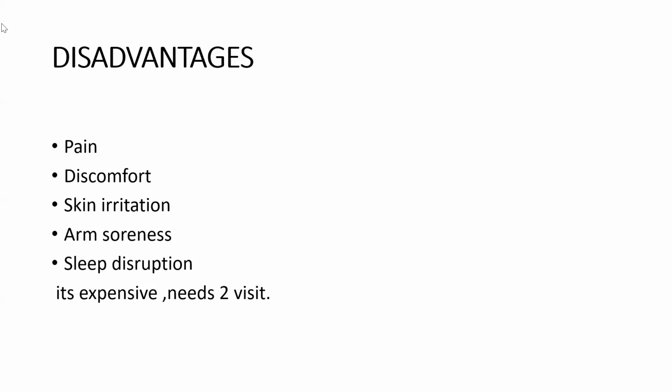I don't know if it's the same thing as nocturnal hypertension. And then there are extreme dippers. If the reduction from their daytime blood pressure is more than 20%, they are called extreme dippers. Reverse dippers, I also saw somewhere, are also called risers or nocturnal hypertension.